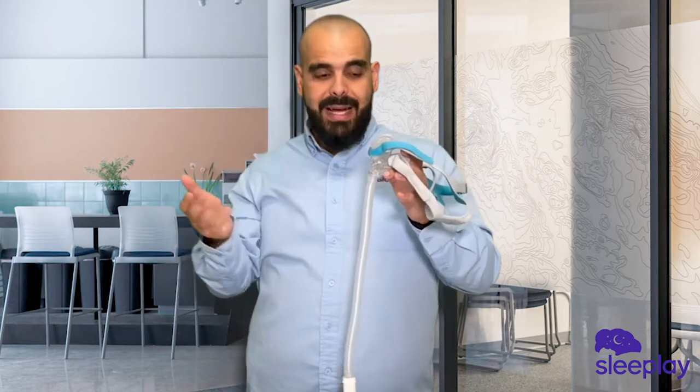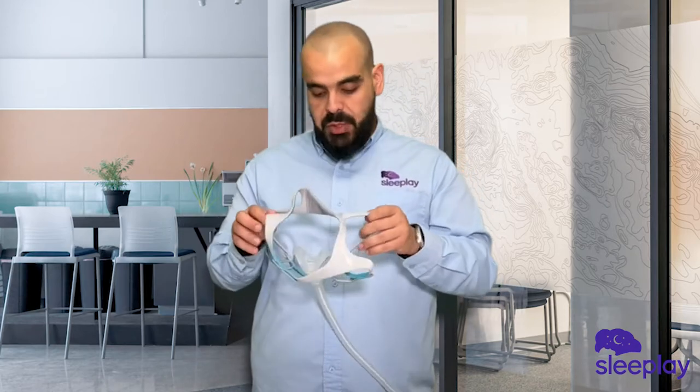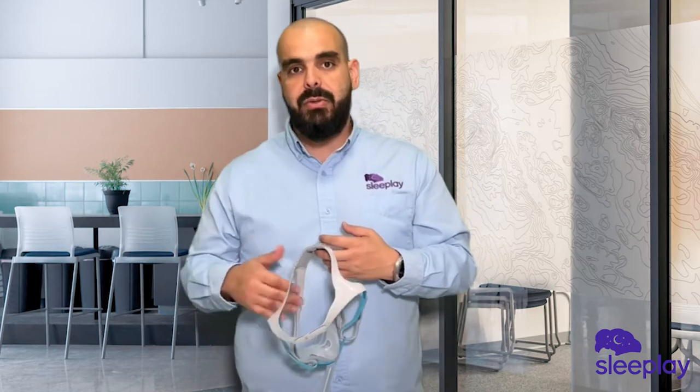You will notice that the tubing does come out the front — it's not on top of the head like other masks — but sleeping with it one night, it was not too bad. I've slept with full face masks with the tubing in the front before, so I'm used to it.